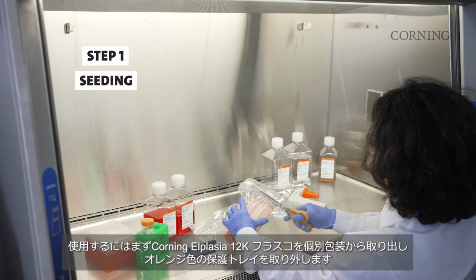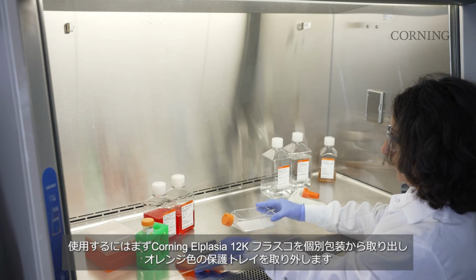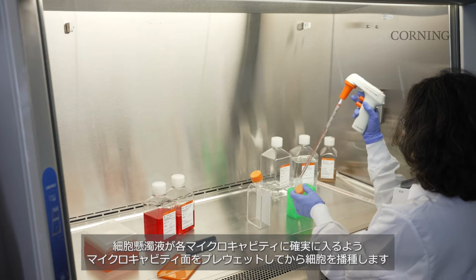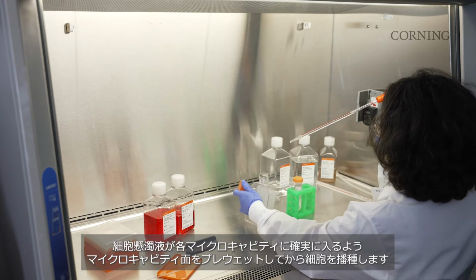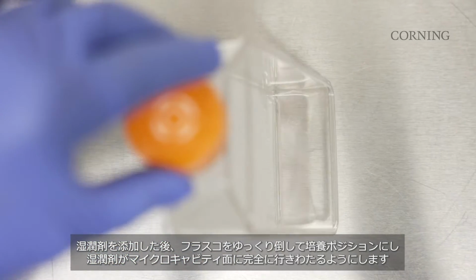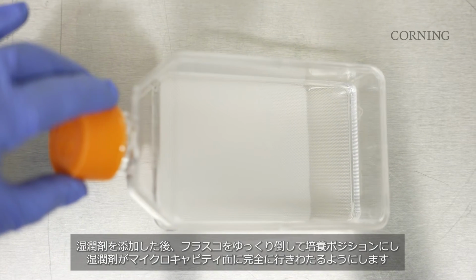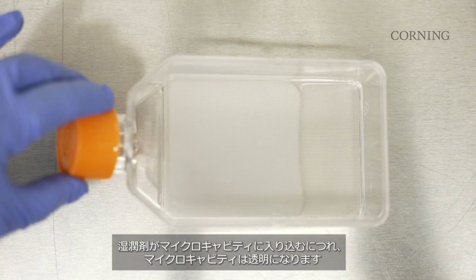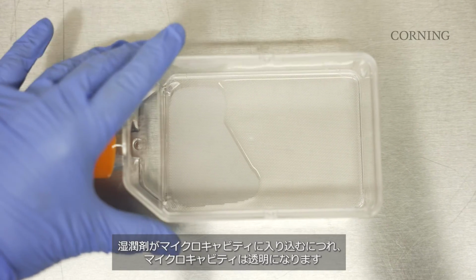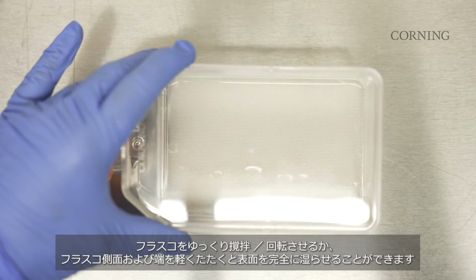To get started, remove the Corning Elplasia 12K flask packaging and orange protective tray. The microcavity surface should be pre-wet prior to seeding cells to ensure the cell suspension enters every microcavity. After adding the wetting agent, gently bring the flask down to the incubation position, allowing the liquid to fully distribute across the microcavity surface. As the wetting agent enters, the microcavities will become optically clear. Gentle agitation or tapping may be required to fully wet the surface.